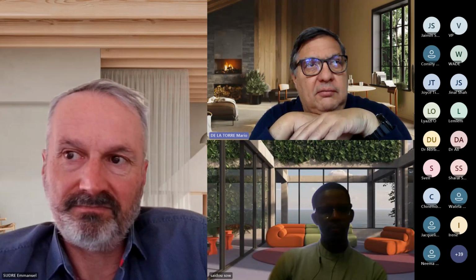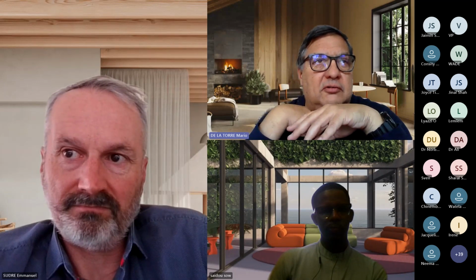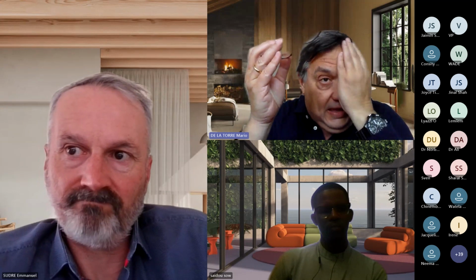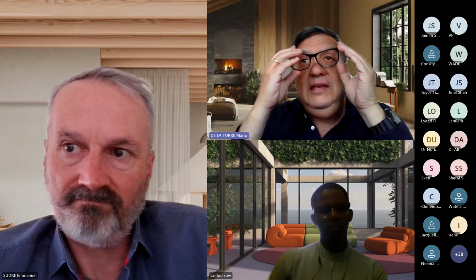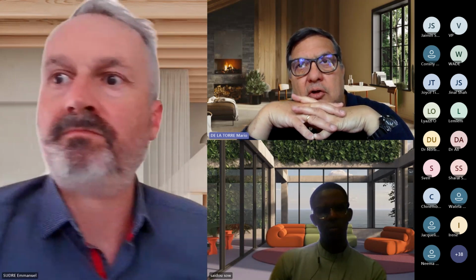If I don't have any issues with the intraocular pressure rising, I have no medication as well. And if I see it at 1 or 2 weeks, in my experience, according to the Dr. Sampaolesi protocol, I do a second treatment with SLT. It helps me a lot because I can control the pressure, and some of the patients don't need eye drops as well.